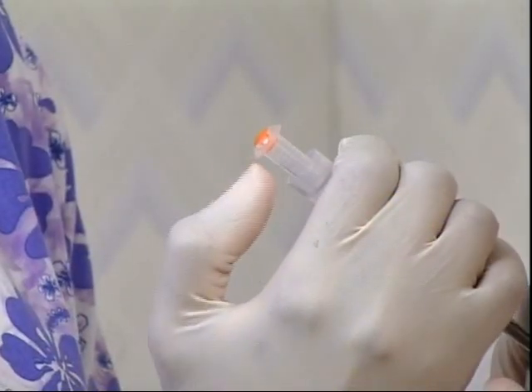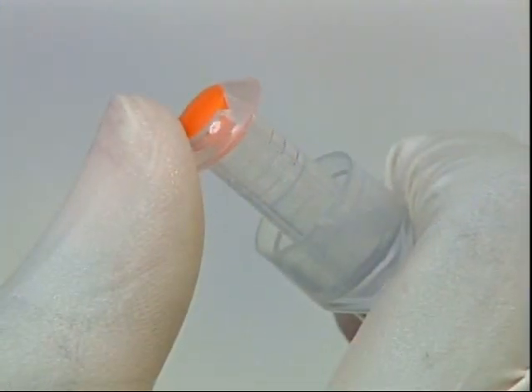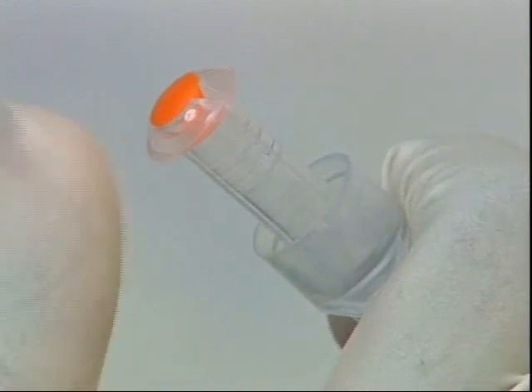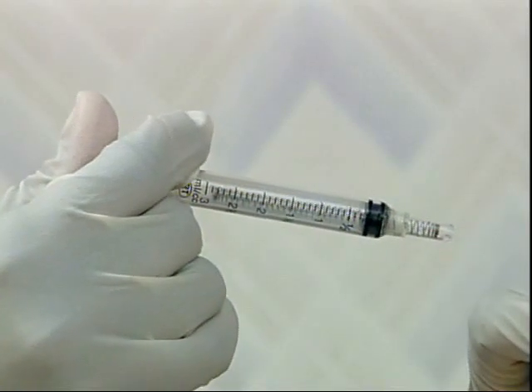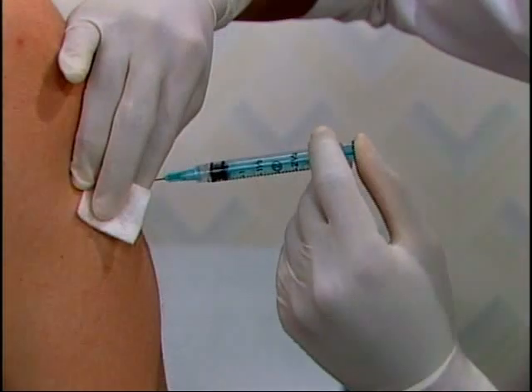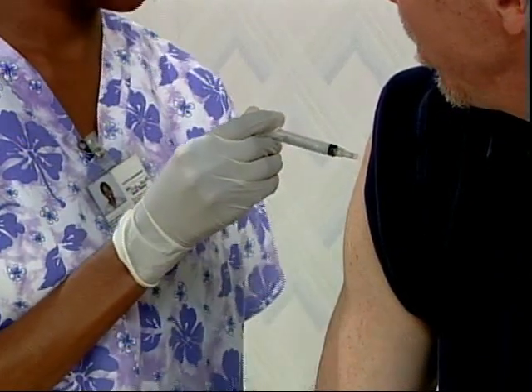An alternate activation method is to grip the barrel of the syringe with your fingers and depress the plunger with your thumb. If aspiration is indicated, it can be easily done using either technique. Once the safety mechanism is activated, the needle will automatically retract directly from the patient into the barrel of the syringe. Most needle stick injuries occur within seconds after the needle is removed from a patient. Activating the retraction mechanism while the needle is still in the patient virtually eliminates the risk of a needle stick injury.